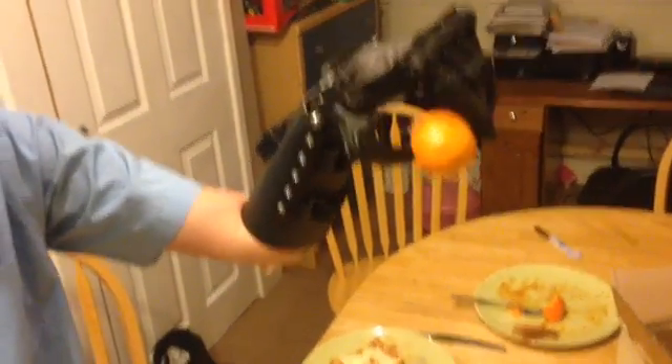Now peel it. Give me that — it's good, isn't it? Yeah. Now put the banana on the table. There you go. Is there anything you want to say about it? It's very good. Show us again.